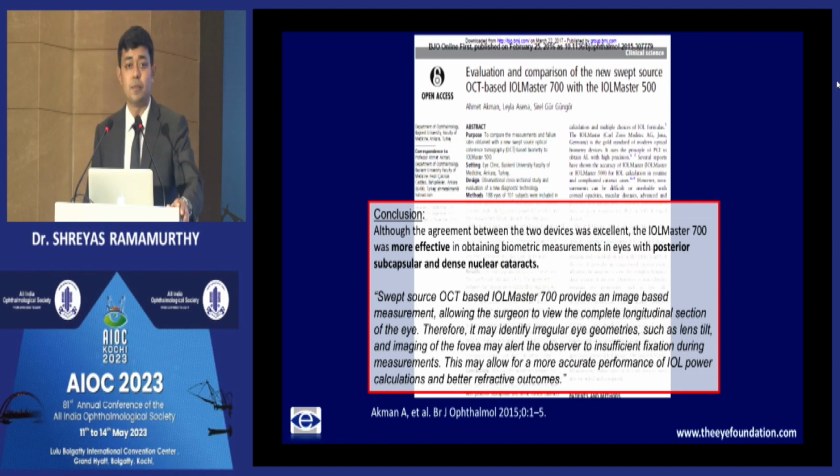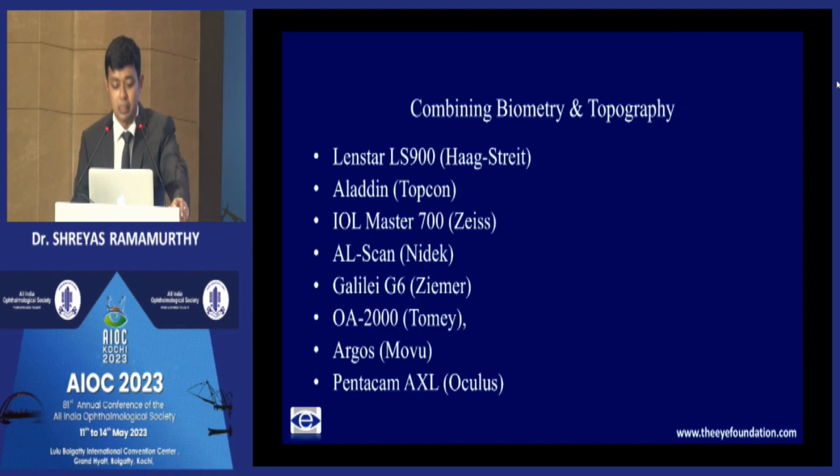The penetration of these swept source OCT devices is also much better, and it's very few cataracts nowadays that you're having to shift to immersion. Most of them we are able to do with the optical biometer.